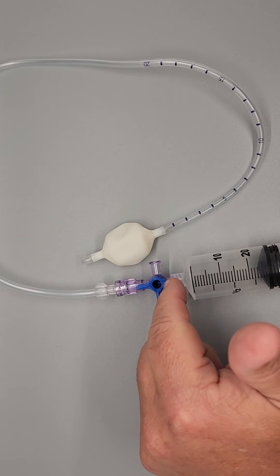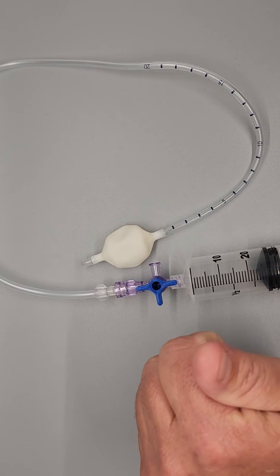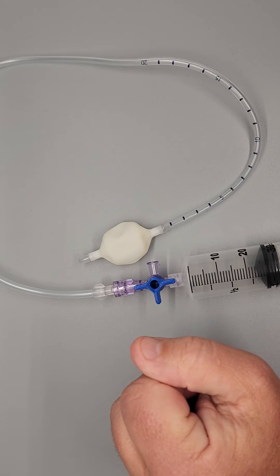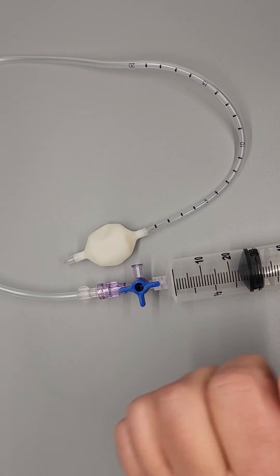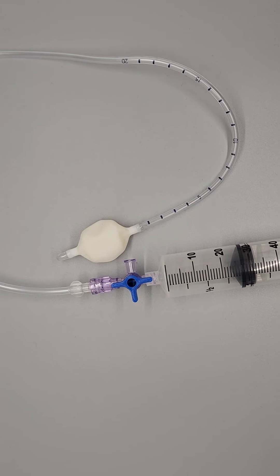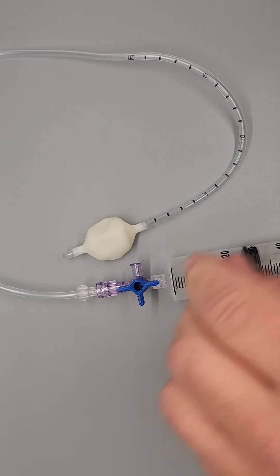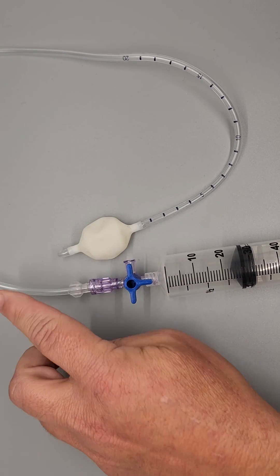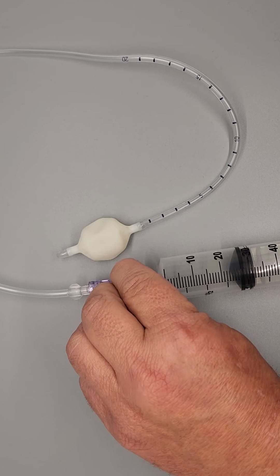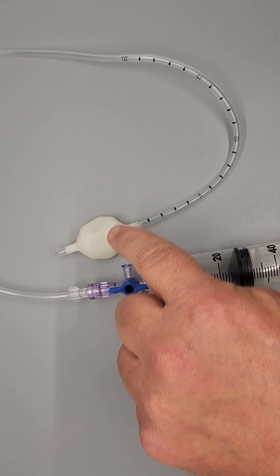You'll notice that this stopcock has three points here, and they're all different ports or outlets, and I think that's where people get confused. What I'd like you to focus on is the flat part. The flat part of the stopcock is the blocking portion. So if I have it turned here, I'm blocking off the catheter. If I have it turned here, I'm blocking out the outlet port.